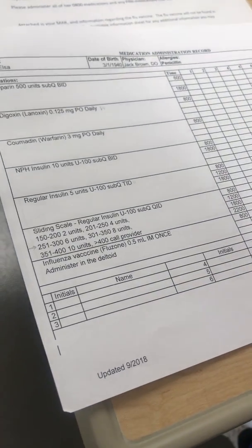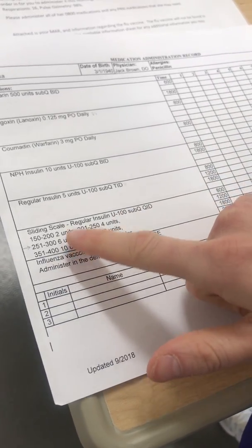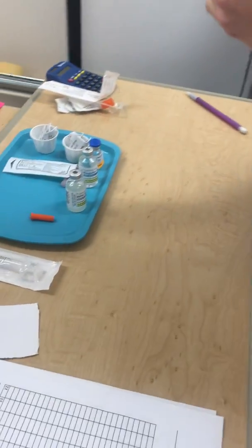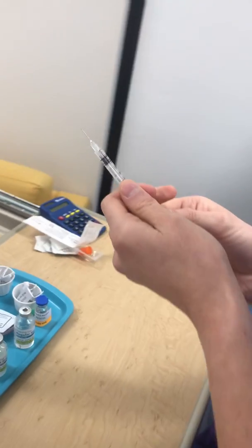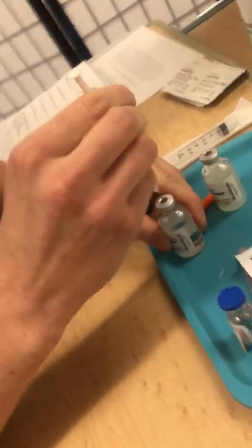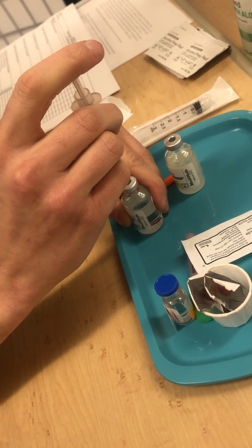And then according to the sliding scale, her blood sugar was 264, so according to that, we'll have 11 regular, so a total of 21. So we'll insert, there's 11, and then we'll insert the air into here. Not touching the liquid, 11 units, and then we'll pull back 11.